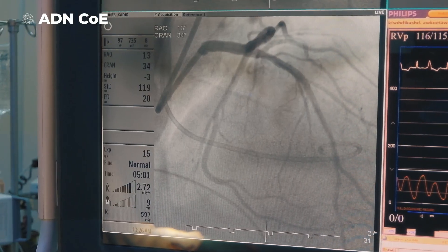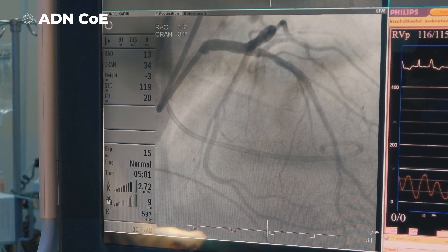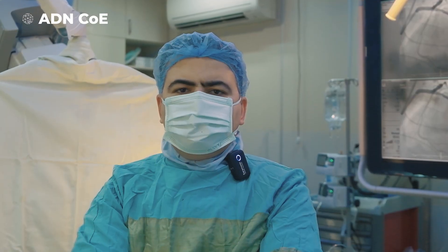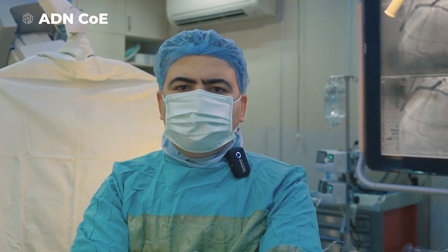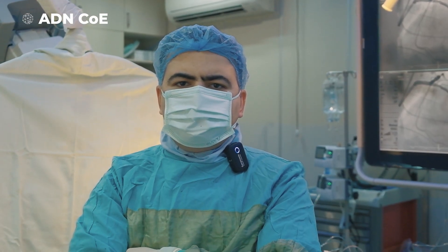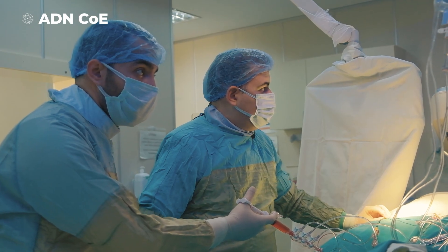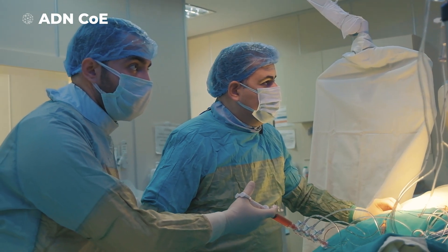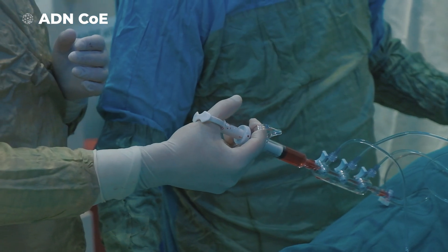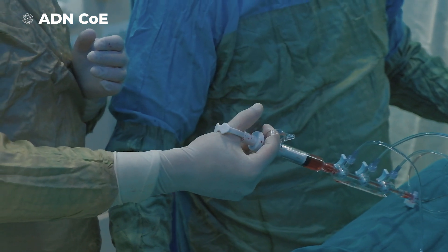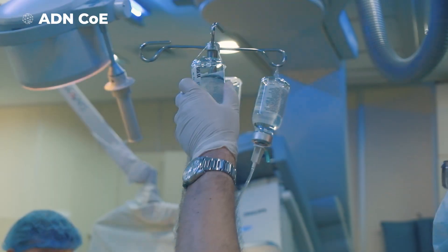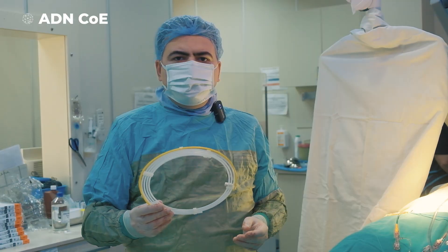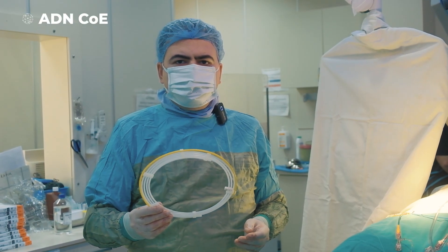In this step, we take a picture of the left main system and identify the septal artery branch. For passing through the septal artery, we are using a floppy guidewire.